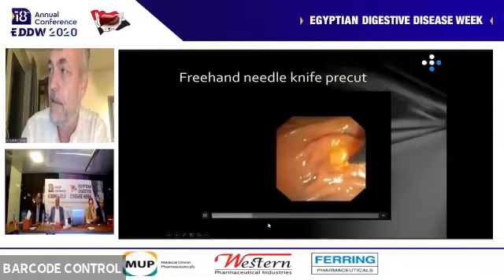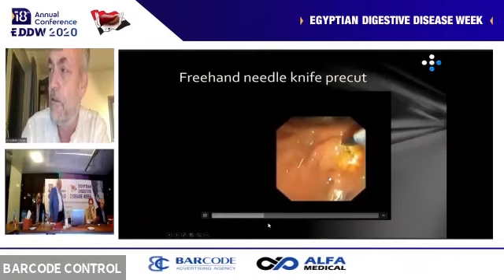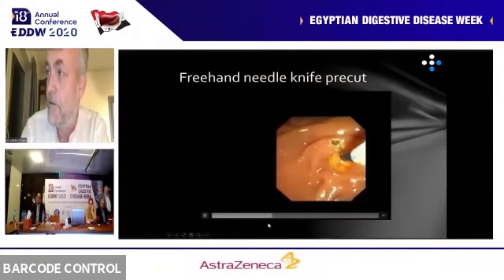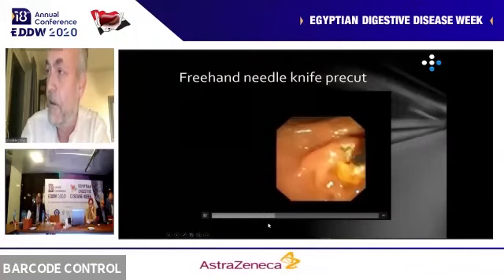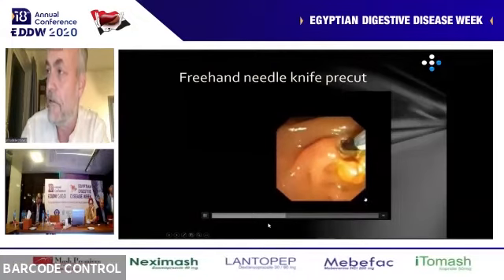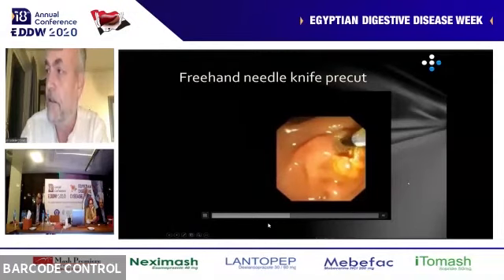And you really need to cut far enough for the tissue to open up, because otherwise you have no visual idea where to direct your subsequent cannulation attempts. So you do this layer by layer, you try to open it up, and then you change your needle for your catheter, and then try to target ideally some visual bile duct orifice.